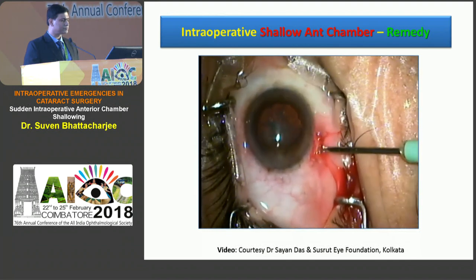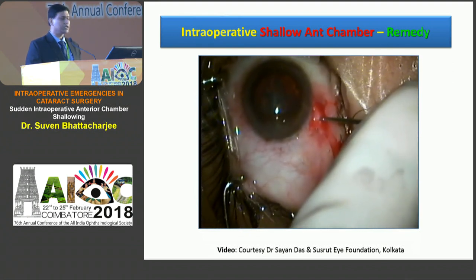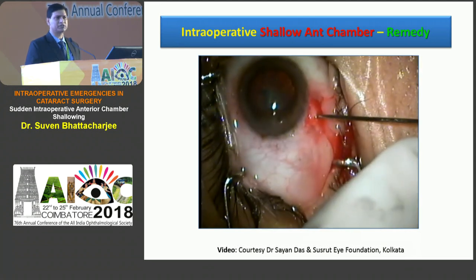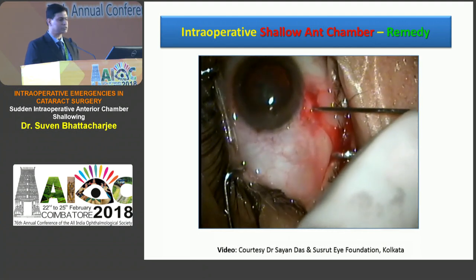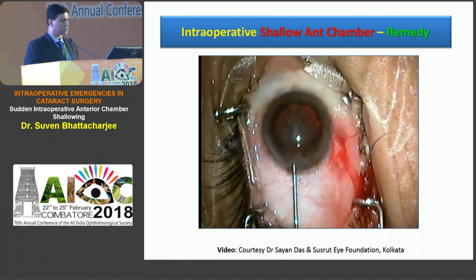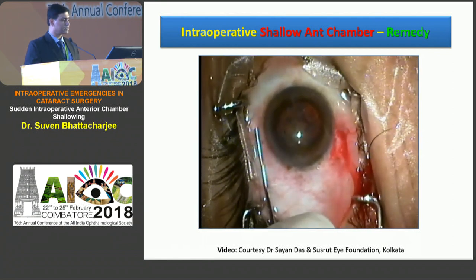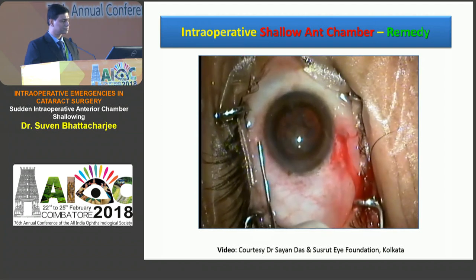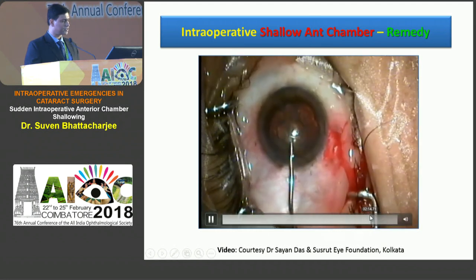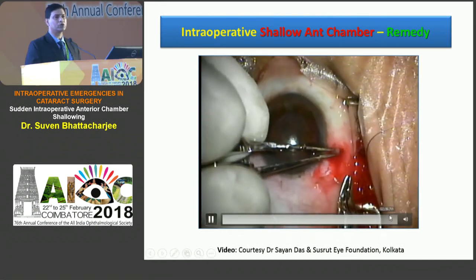A 23-gauge MVR blade was used — you may not have time for a trocar or it may not be available. Go in with the 23-gauge vitrectomy blade; if you have sufficient visibility that's fine, otherwise go in blind into the retrovitreal space or mid-vitreous and perform a short vitrectomy. You don't need to remove a great deal — about 0.2 to 0.3 ml should serve the purpose. After checking, the pressure normalized, the anterior chamber began to form, and the case moved into the safe zone. Further vitrectomy was performed, the AC was well-formed, pressure was controlled, the port was closed, and surgery was completed.